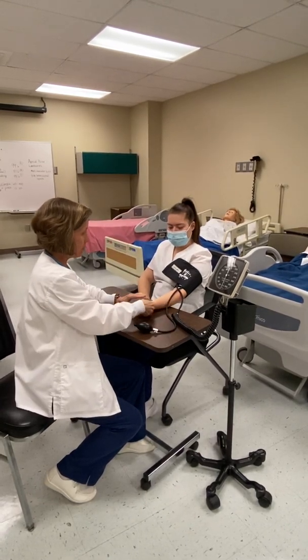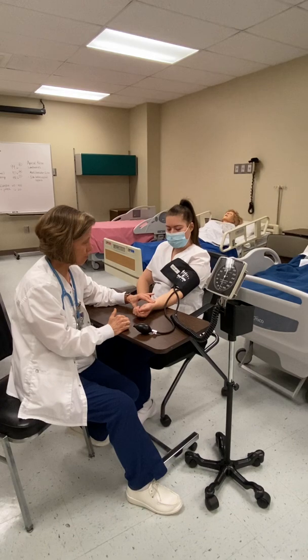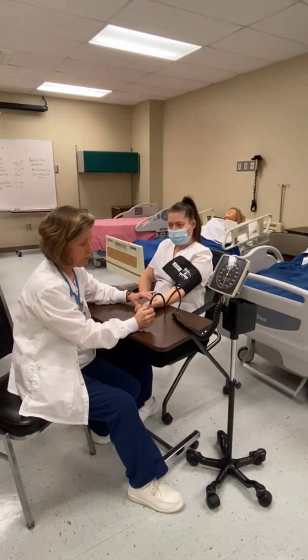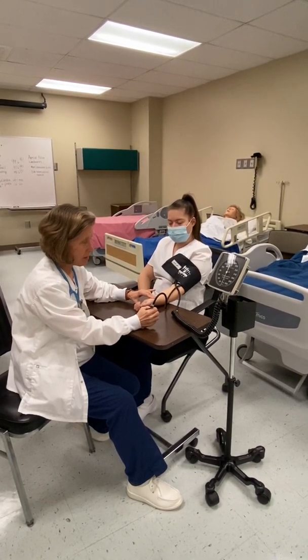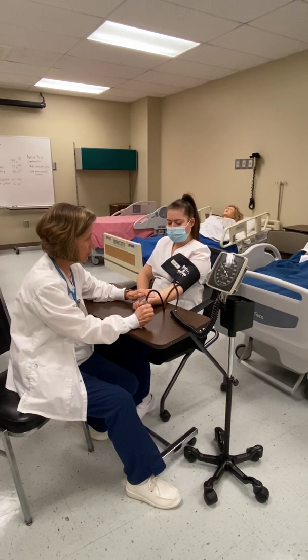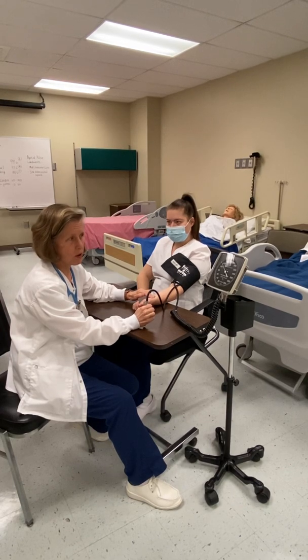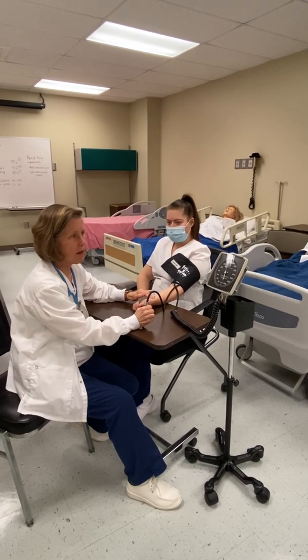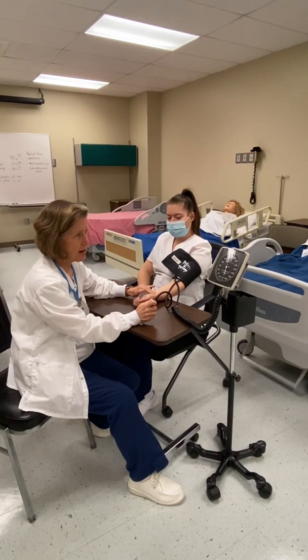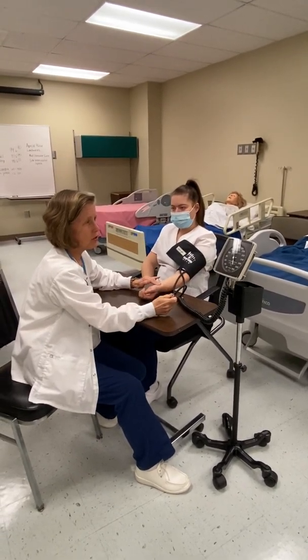I'm going to palpate her radial pulse — she has a nice strong pulse. I'll close the screw valve on my bulb and pump it up gently until I can no longer feel her pulse, because the cuff will occlude that blood flow. At about 120, I no longer feel that pulse. So I'm going to pump it up 30 millimeters of mercury above that, to about 150. Then I'll very slowly let the air out of the valve, watching the manometer and waiting for the return of that pulse.